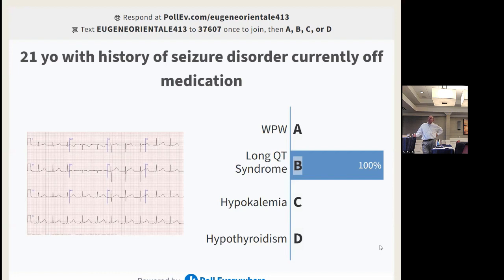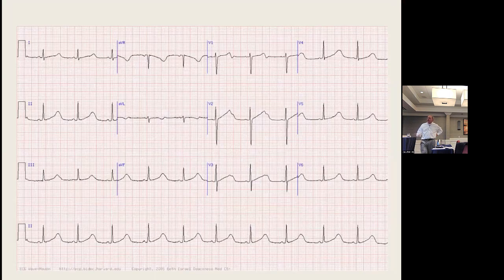This would be in a 21-year-old, you would think about congenital prolonged QT versus drug effect causing a prolonged QT. Now let's talk about the QT. First of all, let's identify this EKG as a perfect example of a rhythm strip, lead 2. Nice lead depiction of lead change. Isn't this nice? It's color coordinated for us. Labels the leads, tells us everything.